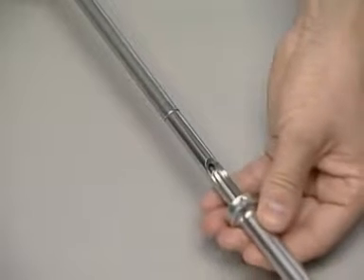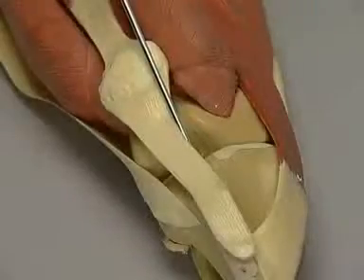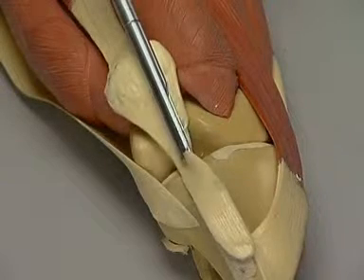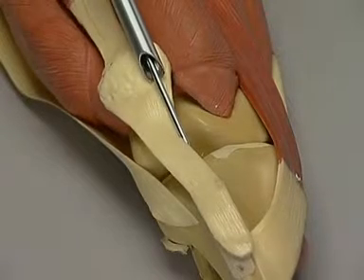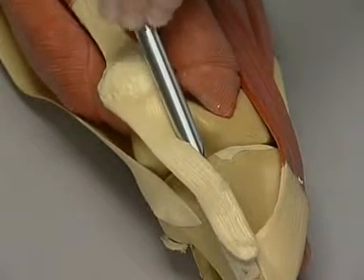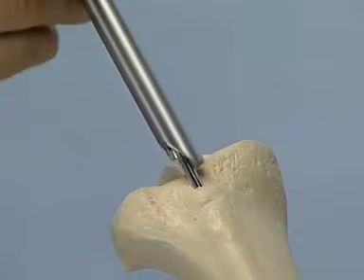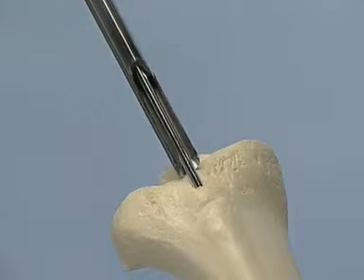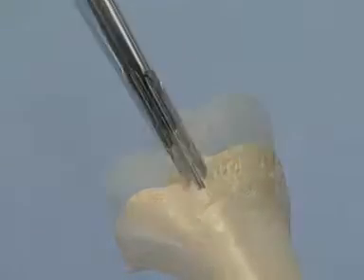The protection sleeve is slid over the cannulated cutter. If the cannulated cutter is used without the protection sleeve, it is very easy to injure the patellar ligament. For demonstration purposes, the protection sleeve will not be used here. The opening to the medullary canal can now be cut by rotary movements.